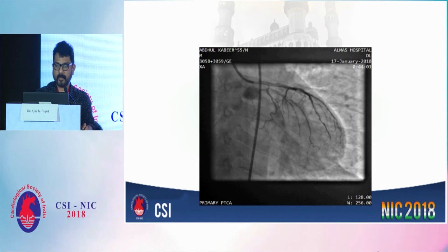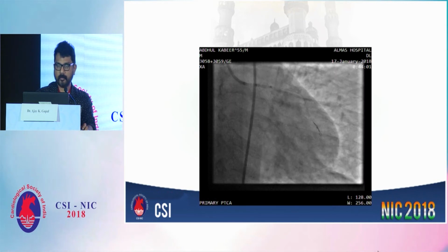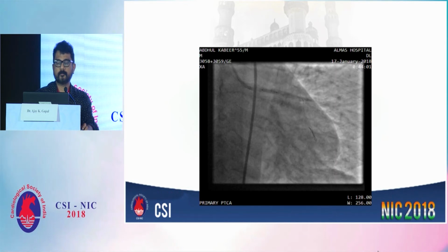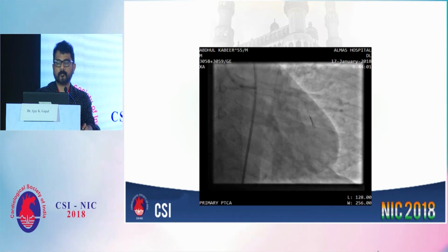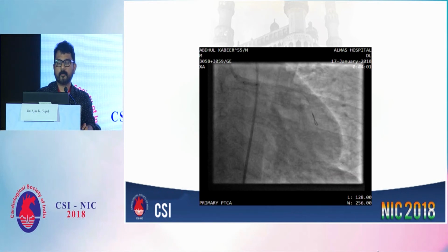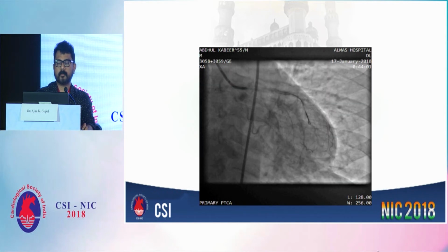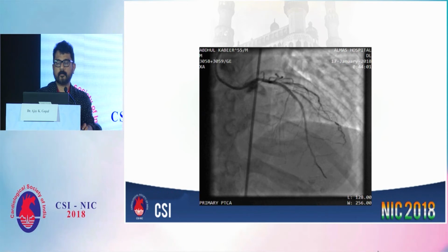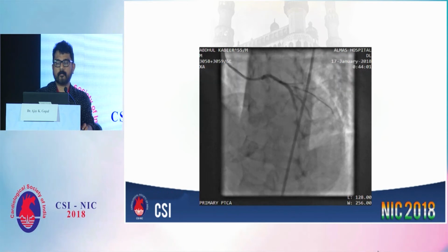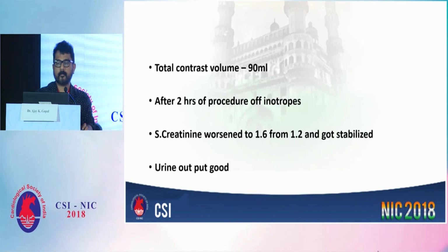So I decided to post dilate the left main and ostial LAD with a 3 NC balloon followed by a 3.5 NC balloon. The ostium was flared. This is the final result. So we finished the procedure with 90 ml of contrast.